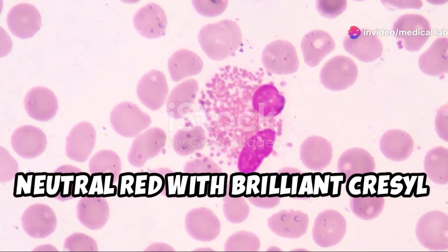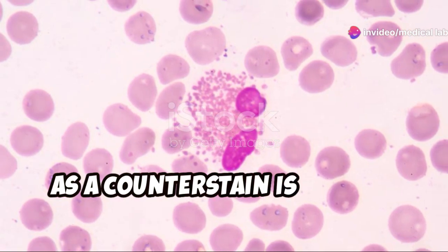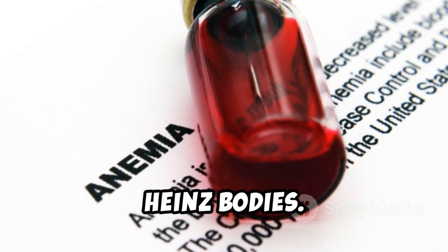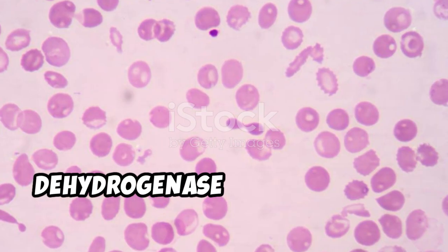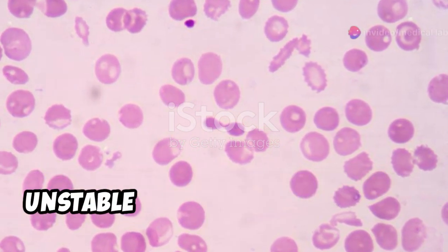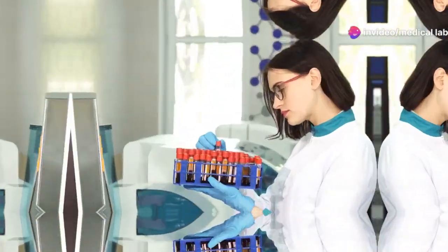Neutral red with brilliant cresyl green as a counterstain is used to visualize Heinz bodies. Clinical disorders associated with Heinz bodies include glucose-6-phosphate dehydrogenase deficiency and other unstable hemoglobin disorders.